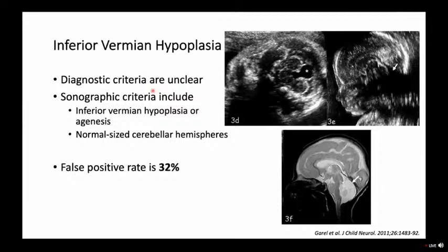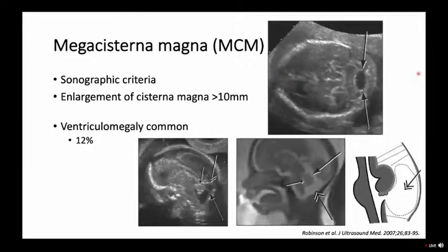So the cerebellum and the posterior fossa are nice and low in the head. They're not up in the tentorium due to that cyst, Blake's pouch cyst. This is a real common overcalled diagnosis. So look for a little tissue and absence in the center of the two cerebellum golf ball kind of structures. That's going to be that vermian hypoplasia.